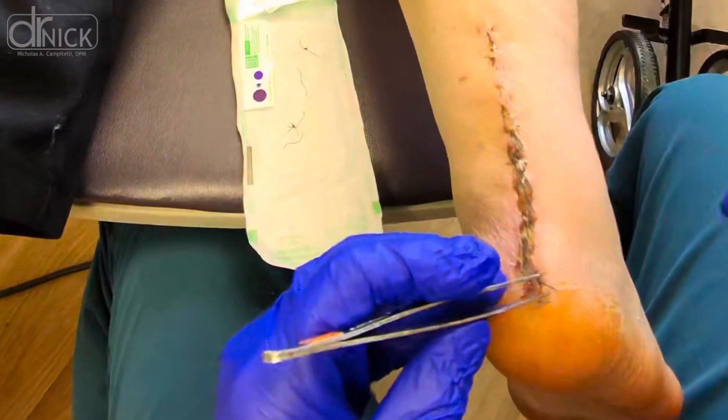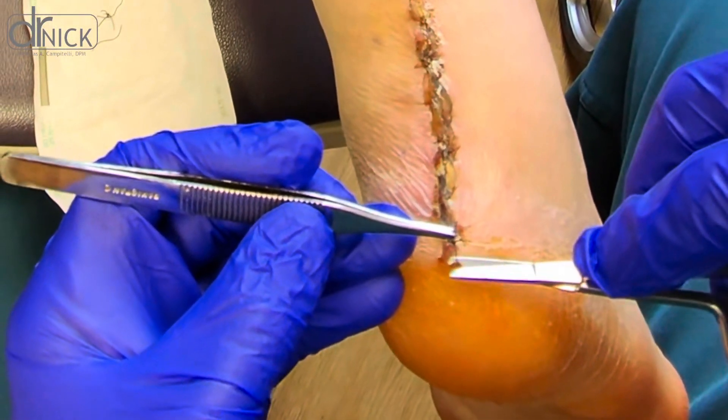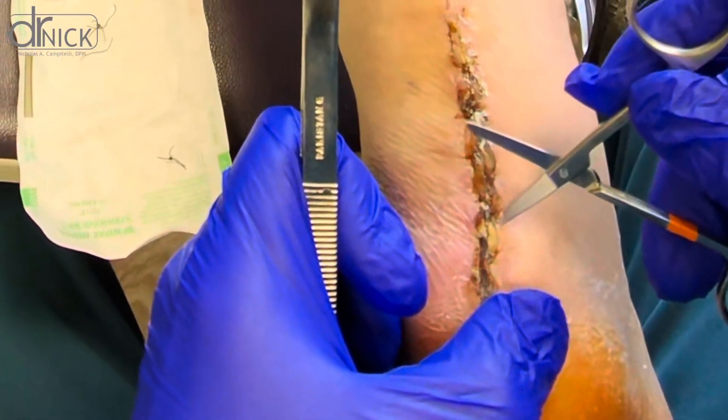The patient has had a successful recovery so far and this is just one step in their journey back to full strength. It's important to keep the area clean and dry after suture removal, and we'll continue monitoring their progress in the coming weeks.